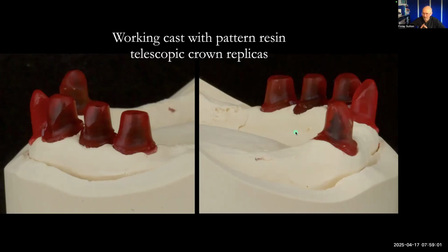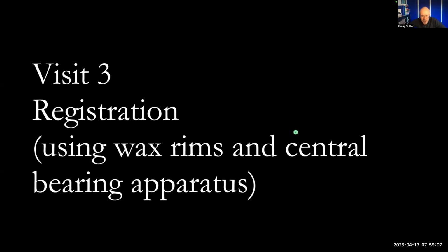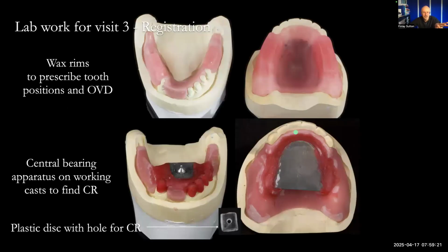So we can now fast forward to visit 3, which I think is super important. It's super important at this stage to do the registration and then do the wax trying of the teeth before we get the metalwork made. Really, really important. So I want to know where we're going to put the teeth first.